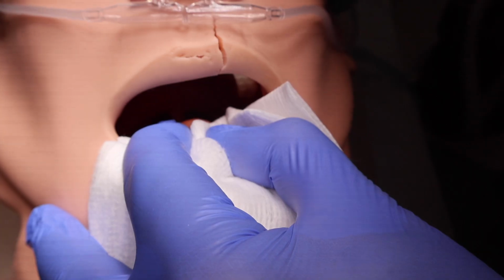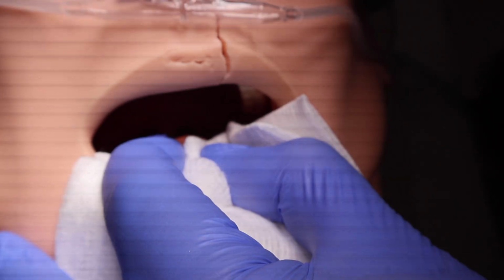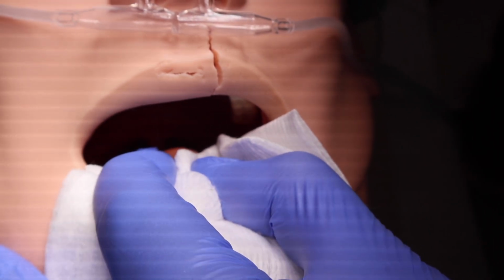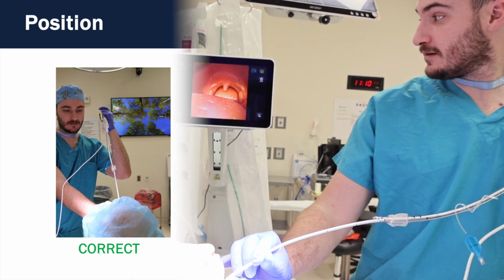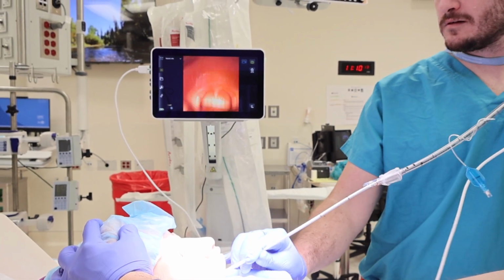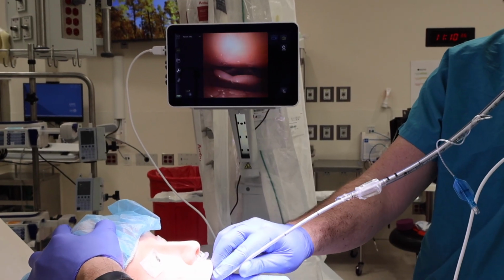At time 0, ask the patient to open their mouth and protrude their tongue. Stabilize the tongue with gauze. Assess the gag reflex. If it is still strong despite topicalization, consider additional local anesthetic. Position yourself at the head of the bed on either the right or left side of the patient. Stand slightly to the side of the patient's mouth so you can maintain a neutral wrist position and direct line of sight to both the patient and the video screen.